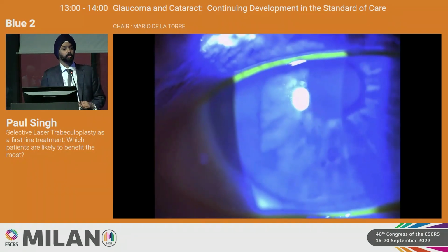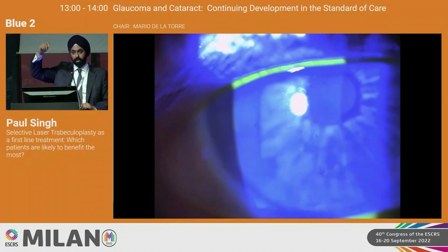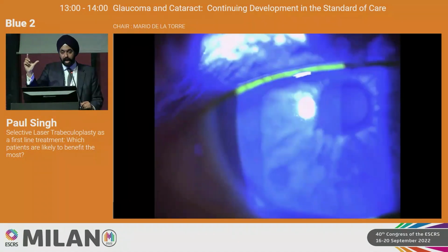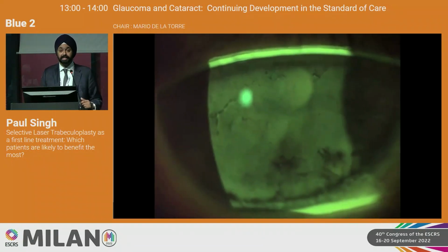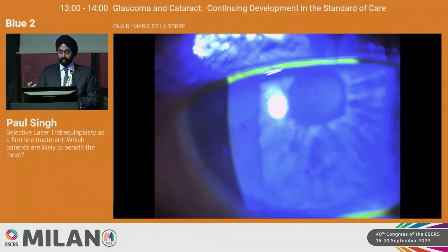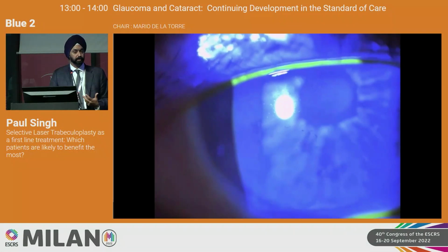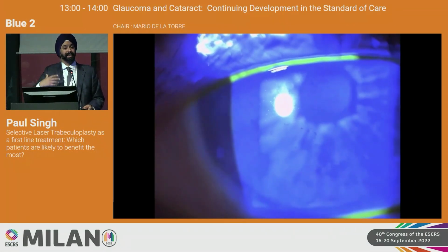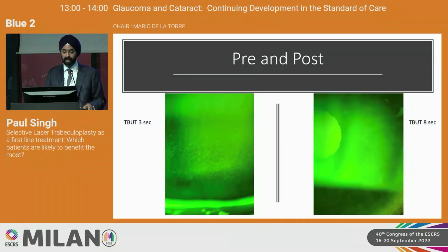Number two, use something called a Wratten filter. There's a filter you can buy. Now, we have a slit lamp that has an automatic filter on it. But on Amazon, there are these $10 filters called the Wratten filter, which allows you to see the tear film so much better compared to a cobalt blue light. There's a blue light. And here's the filter. And you see that EBMD, the unhealthy ocular surface. So many of my patients, I kind of let go. When I started looking for it, you'd be amazed how many patients have concomitant ocular surface disease.